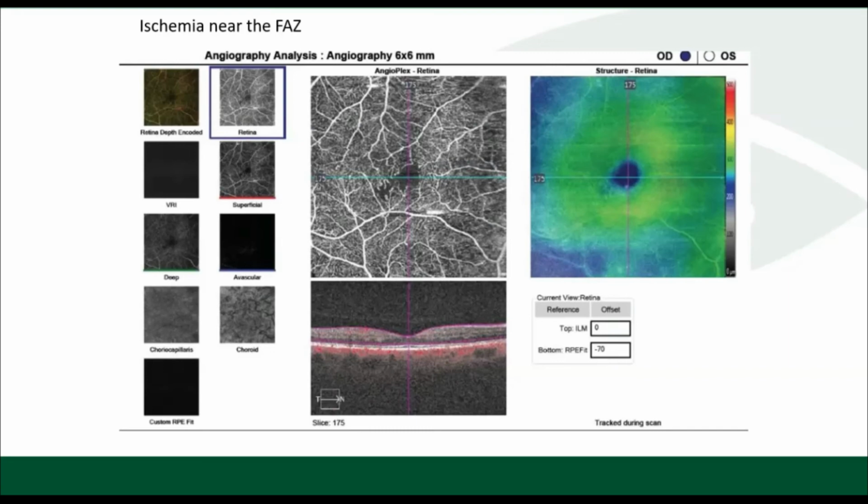I would warn people when they analyze patients with diabetic eye disease and they look at OCT-A, if the patient has diabetic macular edema as well, that might appear different, and you have to be able to differentiate the two, DME and ischemia. But I totally agree with you. It's a super helpful tool for that.